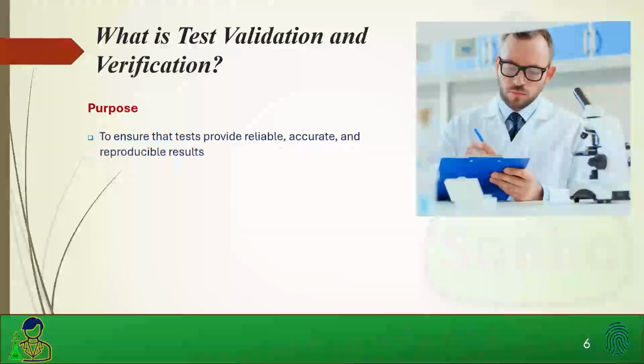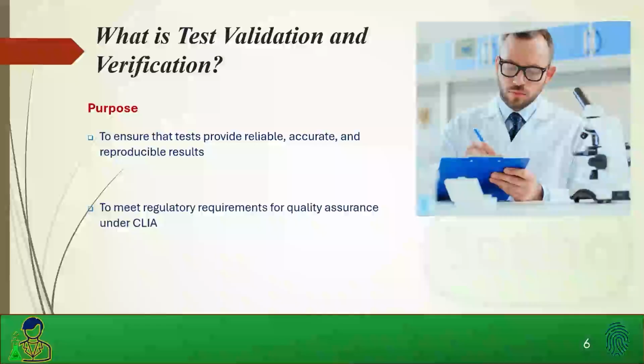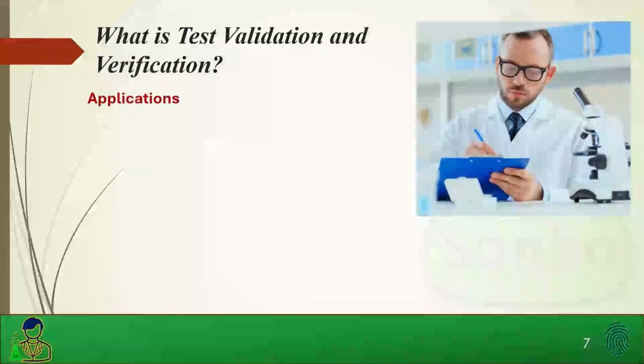The purpose is to ensure that tests provide reliable, accurate, and reproducible results, both validation and verification. That's the purpose of them, and to meet regulatory requirements for quality assurance under CLIA. They both have the same purpose. There's slightly different applications, however.